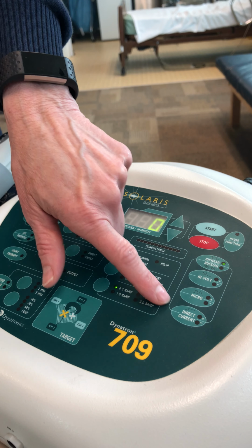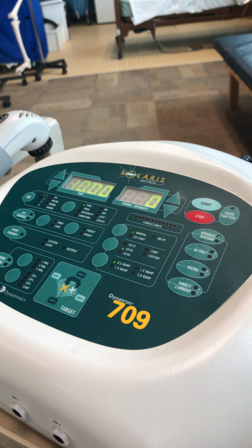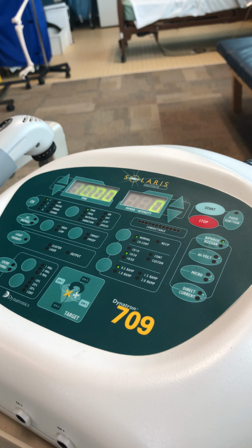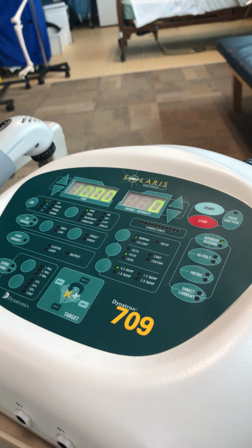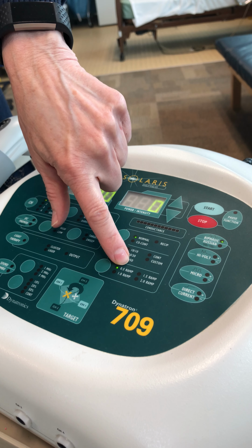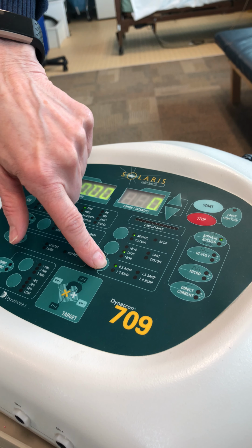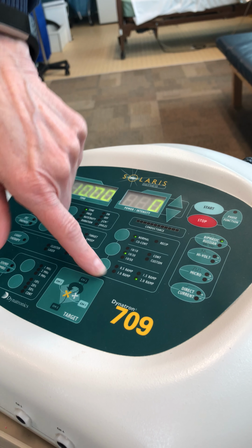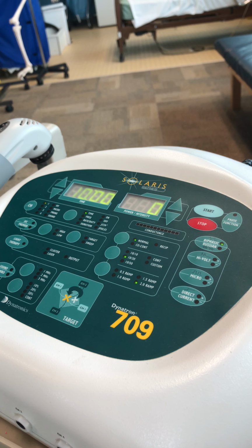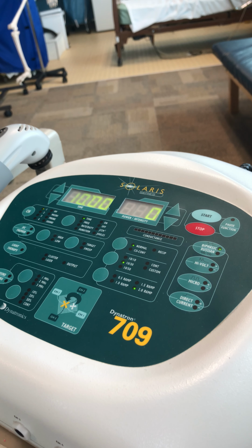And here's the ramp time that I talked about in class. Ramp time is all about what? For the patient, how quickly it ramps up and how quickly it ramps down. So it's all about making it more comfortable for the patient. It starts at 0.5 and goes all the way to 2 seconds, so we are going to go all the way there. Longer ramp times, more comfort for the patient. Good? Okay, so let's look at Alyssa.